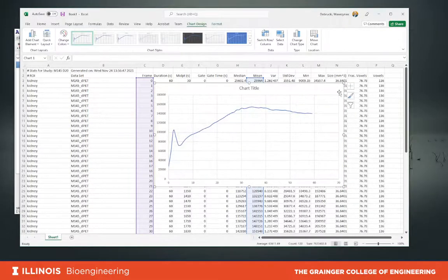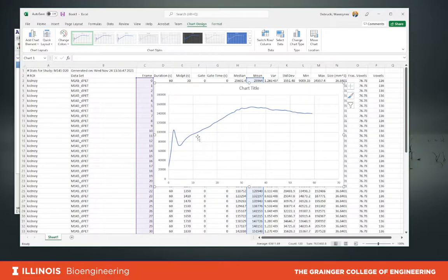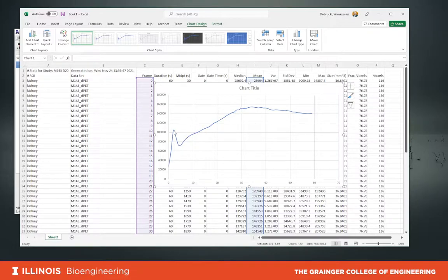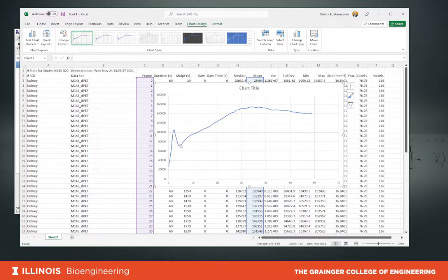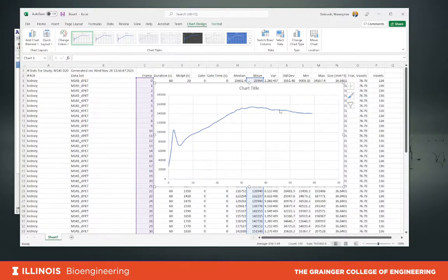Now we have our chart with time on the X-axis and activity on the Y-axis. We can observe over time how the activity changed during imaging. Immediately after injection of the radiotracer, within about two or three minutes, there was an increase in activity in the kidney because the tracer was filtered by the kidney. Then urine production started and there was dumping of urine to the bladder, so kidney activity went down. Then there was continuous filtration accumulation reaching the peak at about half an hour, and then slowly going down.